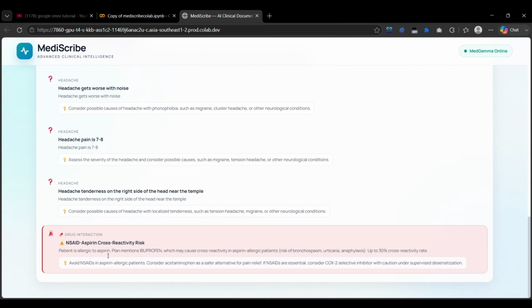It also has drug and drug interactions. Suppose a doctor has told a patient to take a medicine, and the patient history shows that he has taken another medicine which can contradict with the currently prescribed medicine, including with the disease, and cause a reaction. So it can also detect these kinds of details and give red flags and alerts.